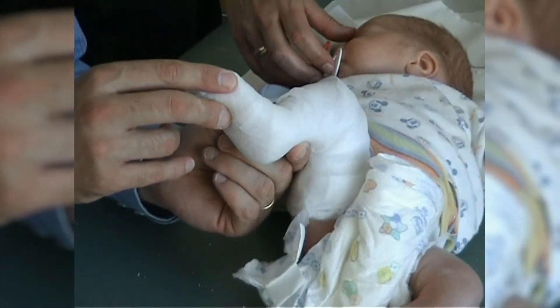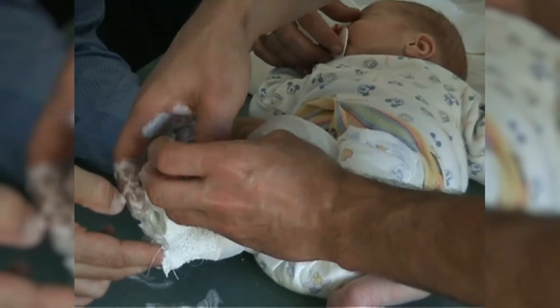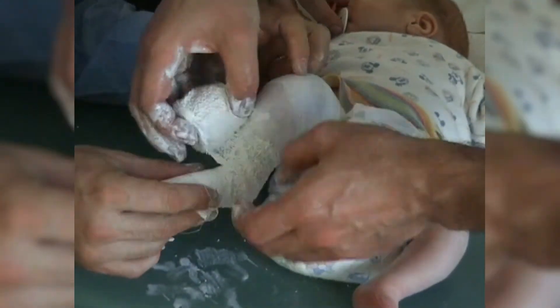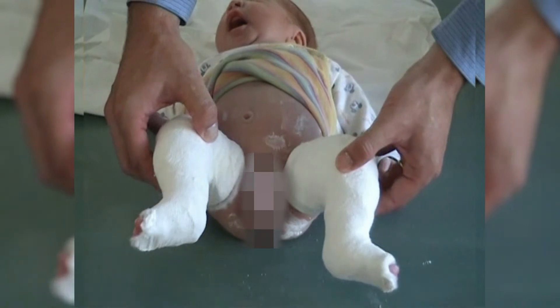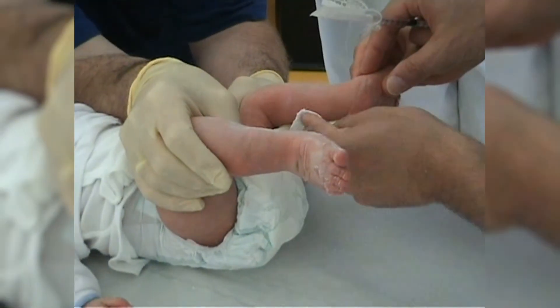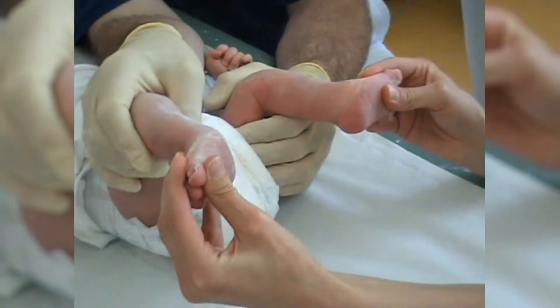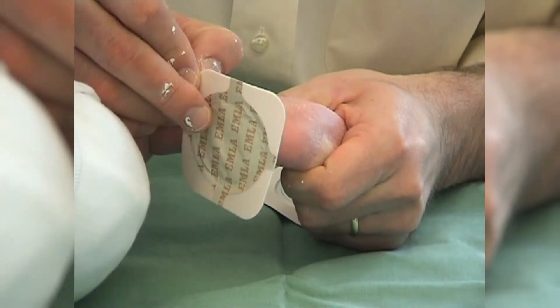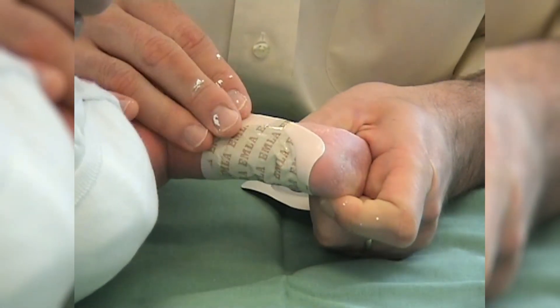About five casting sessions are usually required to obtain correction of the deformity, and 90% of cases then require a percutaneous tenotomy of the Achilles tendon. In this baby, correction is excellent after only three casts. A percutaneous tenotomy of the Achilles tendon is indicated due to the lack of dorsal extension. Tenotomy can be performed at the hospital on an outpatient basis. First, an EMLA plaster is applied in the area where the tenotomy is going to be performed.